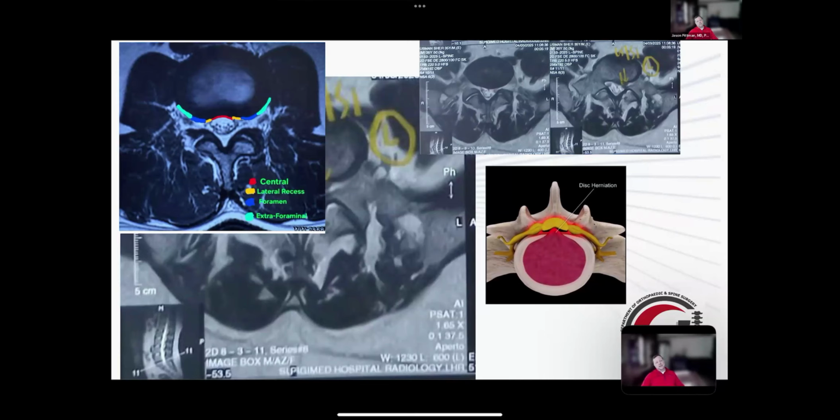But in the setting of a paracentral disc herniation, you just come down right on it like you would a tube, regardless of uniportal or biportal, and come interlaminar at 5-1.